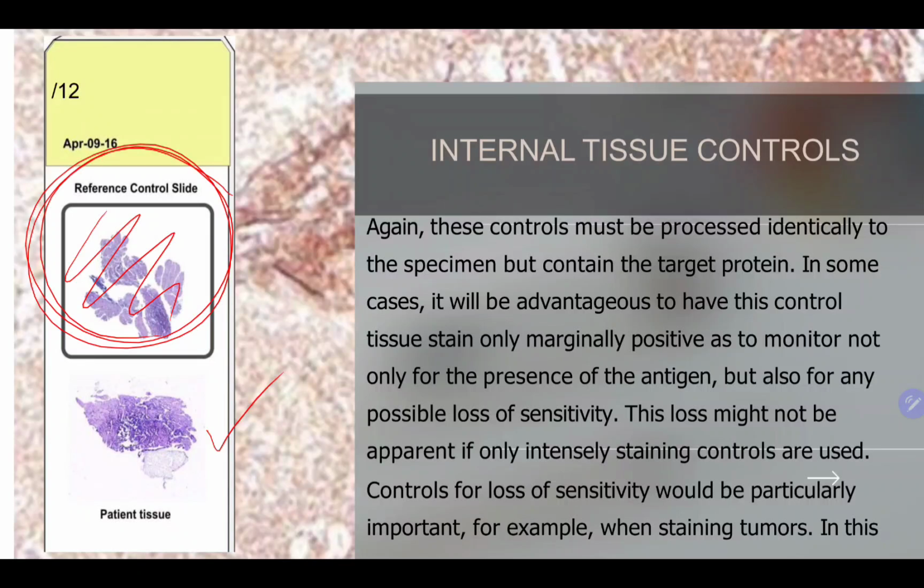Remember po, here in IHC, it's very matagal kasi masyadong procedure. So, ang stains din na gamit natin dito, the IHC stains that we use, over time nag-deteriorate po yung sensitivity nila. So that's why when we do the IHC procedure, usually kinaanuhan natin siya ng control na sample na hindi masyado positive. Kasi remember po, in IHC, pag nag-positive ka, kahit na medyo positive lang yan, it means may cancer, no? The purpose lang ng IHC talaga is to determine the next course of treatment po para sa iyo.